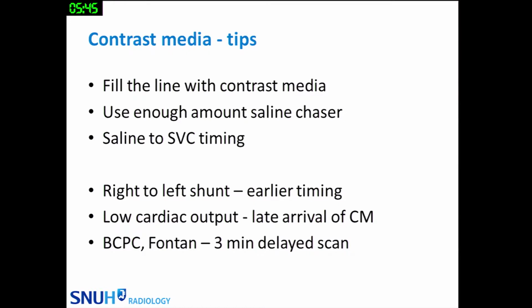If the line is filled with saline, the injection duration is longer, and most of them are injecting saline instead of contrast media. So fill the line with contrast media up to the cannula. And use enough amount of saline chaser, which will give you better imaging quality and better utility of the contrast media.